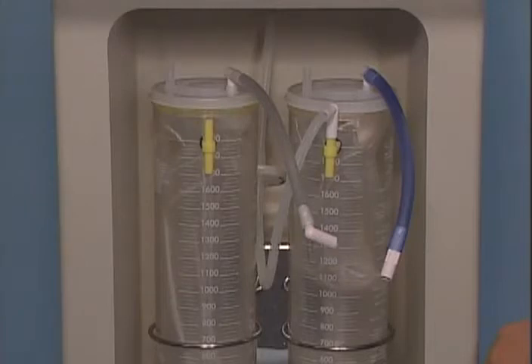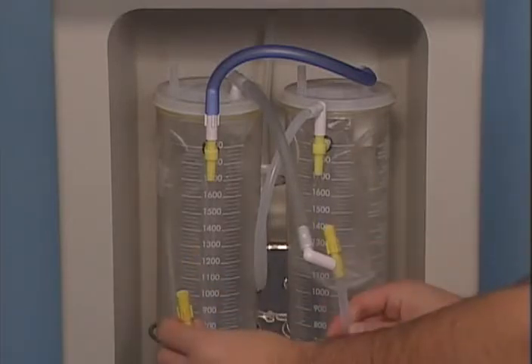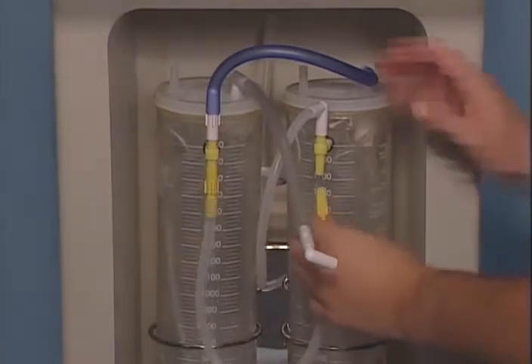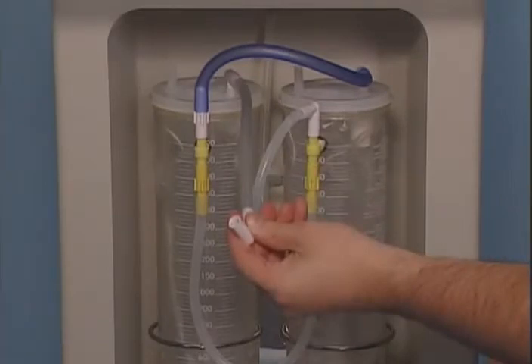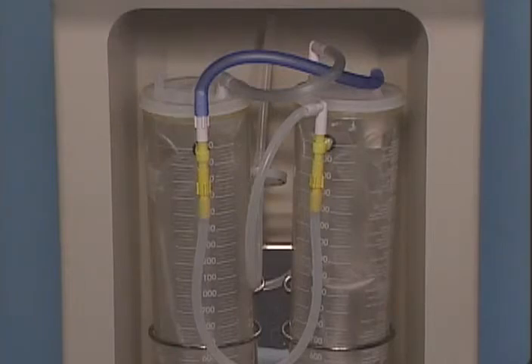Step 4. Take the blue tubing from the filtered canister on the right and attach it to the top of the T on the unfiltered canister on the left. Step 5. Take the reusable tubing with yellow end and attach both ends to the bottom of each receptacle T. Step 6. Take the tubing from the unfiltered canister on the left and attach it to the top of the filtered canister on the right. At the end of this setup, you will notice that the top of the unfiltered canister on the left has a patient port open. This is where the tubing from the handpiece will be connected.